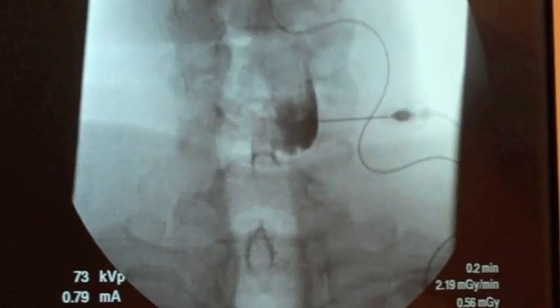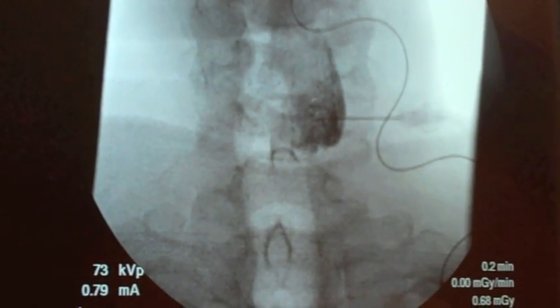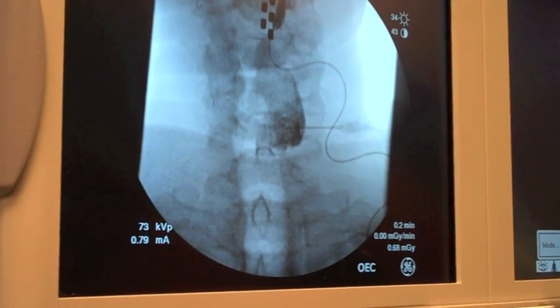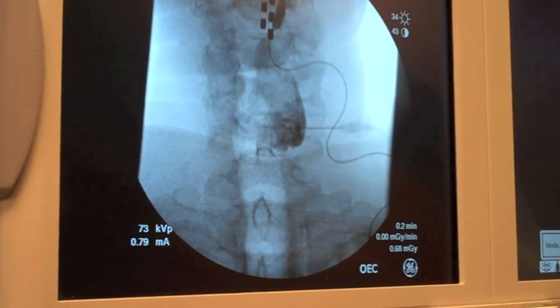Going live here. I'm going to put in the medication now. You're going to feel a little pressure, and we just wait about 15 to 20 seconds. And then we'll put in our other medication.